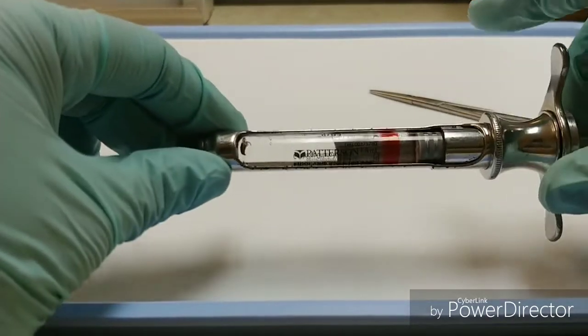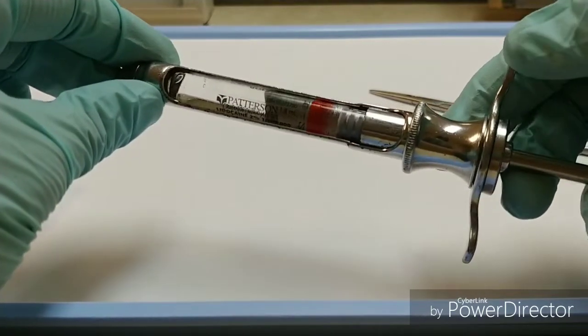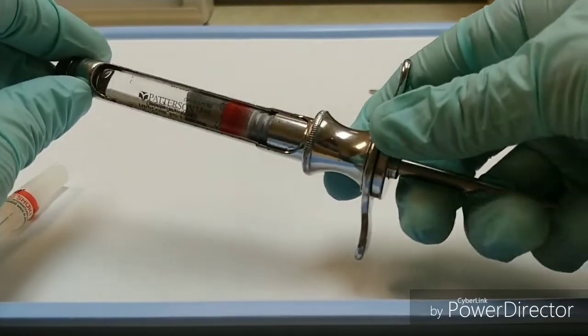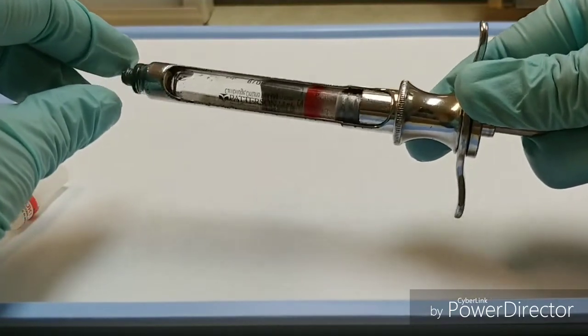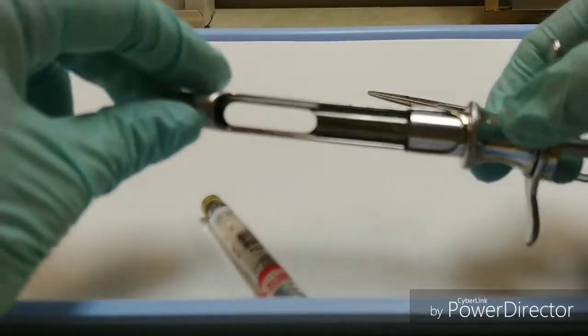Next I'm going to remove the cartridge from the syringe, so I'll have to disengage my harpoon by pulling back on that piston, and then I can just drop this cartridge out.